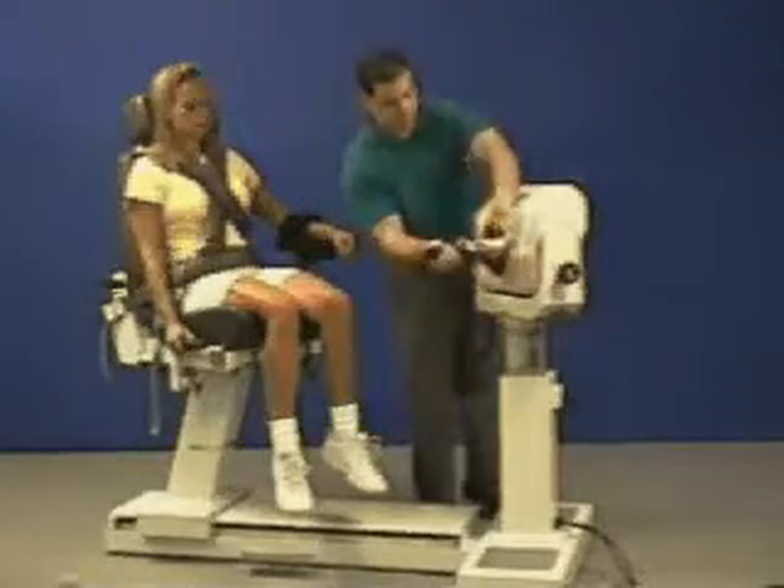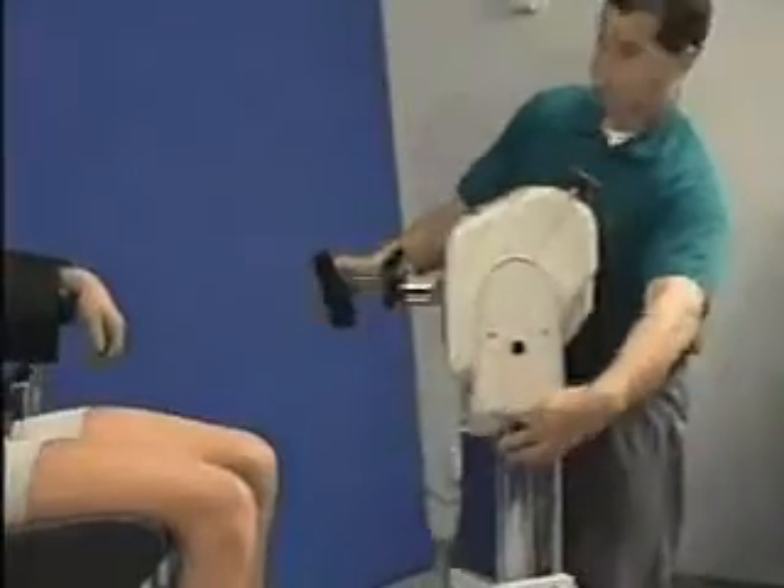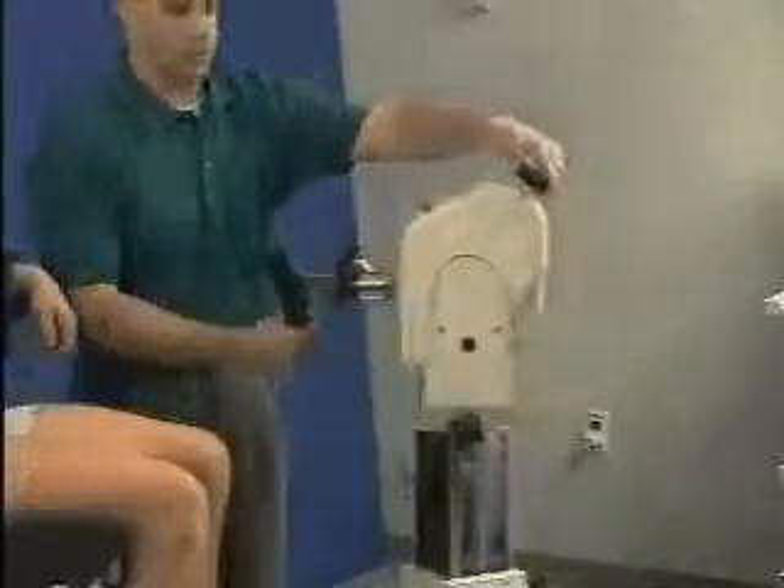Using the red dot, align wrist attachment and secure it. Rotate dynamometer to 30 degrees and tilt downward 5 degrees.